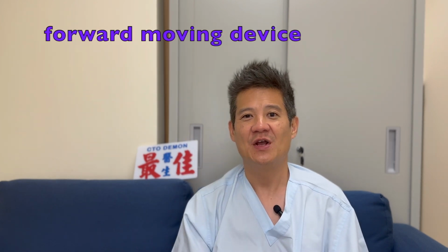No longer should we routinely do side balloon entry because it's not necessary. Wires are forward-moving devices. They penetrate best against things that are right in front of them. It's better to penetrate something in front of a wire than to penetrate something on the side of a wire. There's more penetration force and there's more control. So we should aim to wire towards the end of the balloon and not towards the side of the balloon.